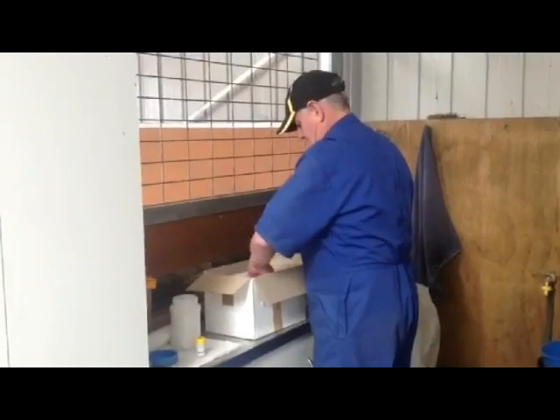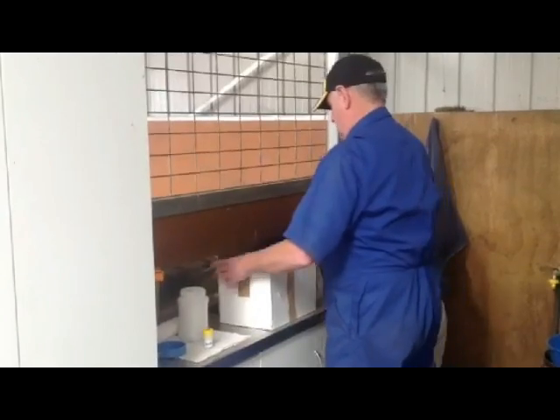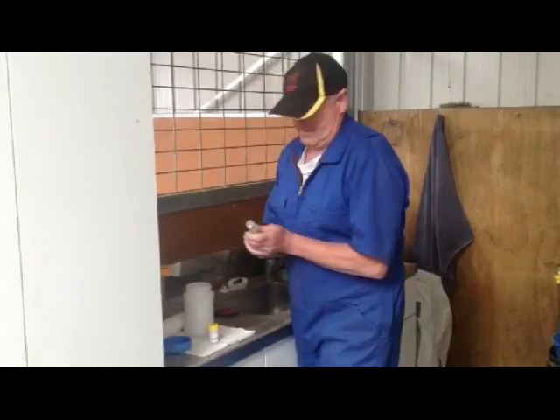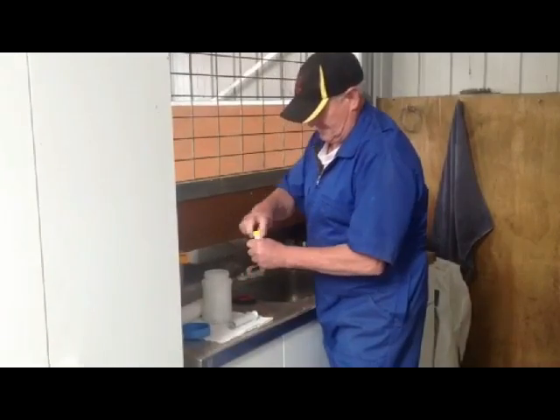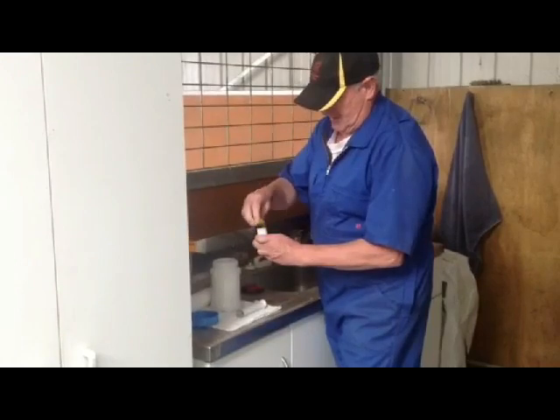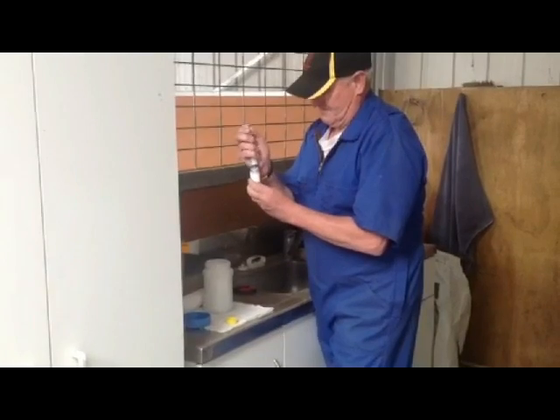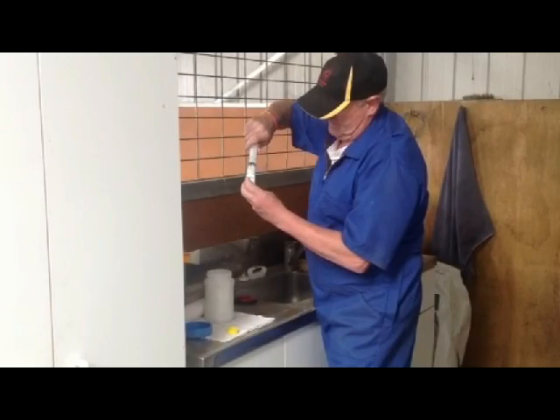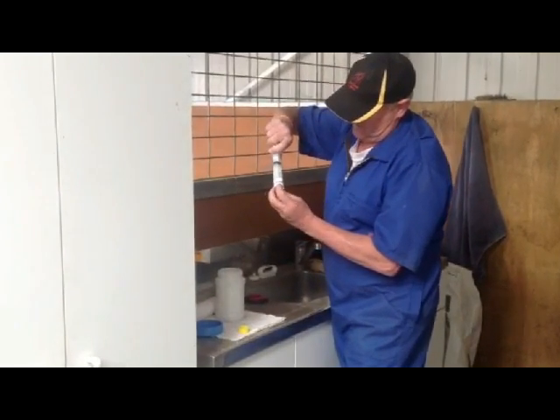Semen arrives here every day about 12:30, either from Alabar or Woodley or Wai Air Farms, and normally comes in a chilli bin at cool temperature. The semen arrives about 25 mils in a vial. We tend to just give it a small agitation to make sure that the sperm cells are spread evenly through the syringe, and then we just suck the 25 mils up into a single syringe. On the odd occasion where we get two vials, we'll use two different syringes.